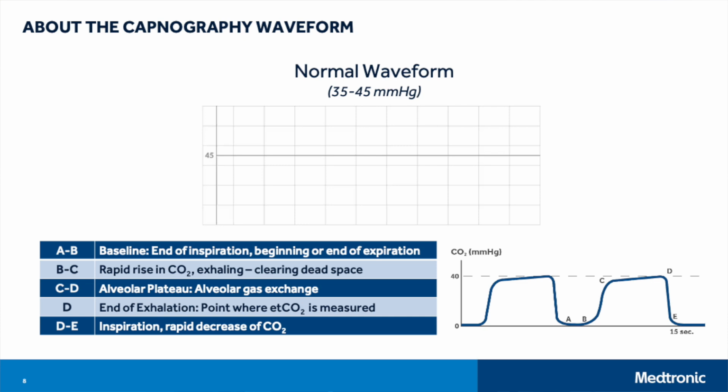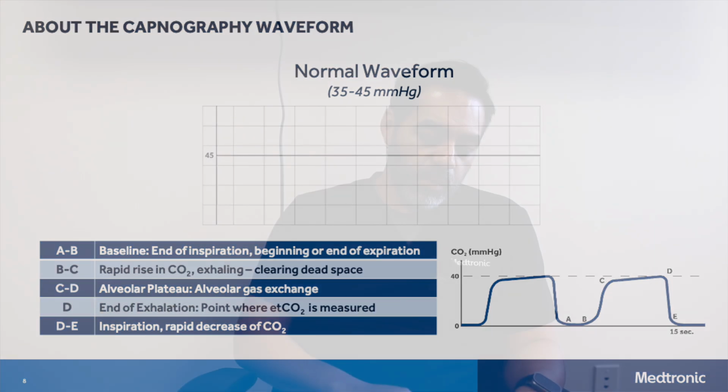As your patient begins to inhale, that number should drop back down to 0, and you should always have a baseline of 0. So it should be a standard square waveform. However, there's going to be some variations.